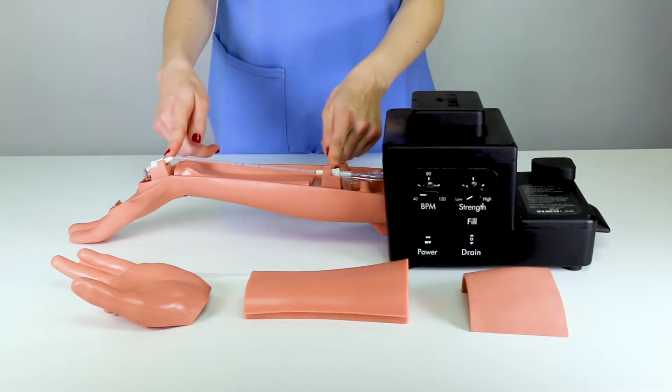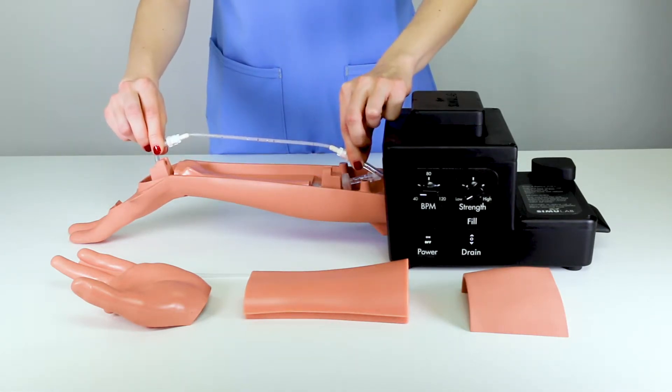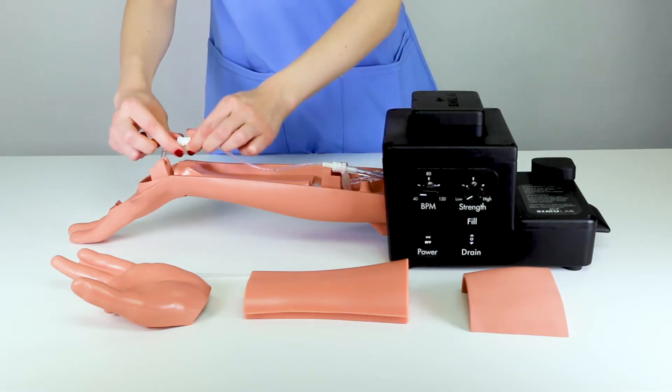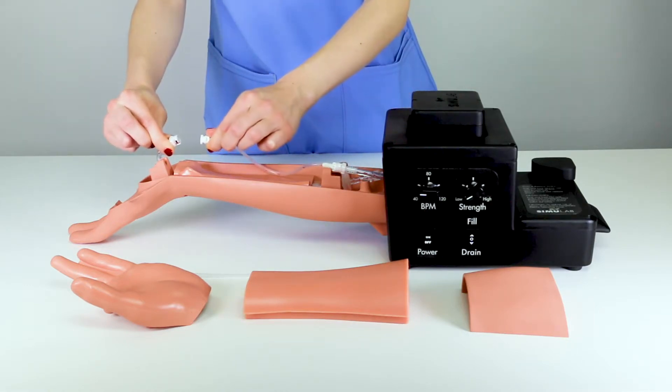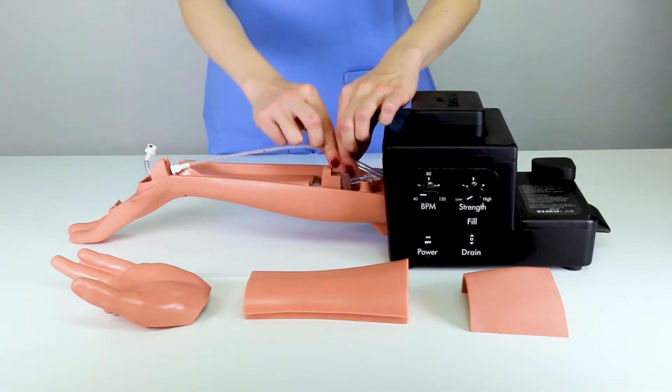Remove the artery from the stands on both ends of the arm. Detach the connectors by twisting counter-clockwise until a small click is heard and felt, releasing the connectors, and repeat on the other side.